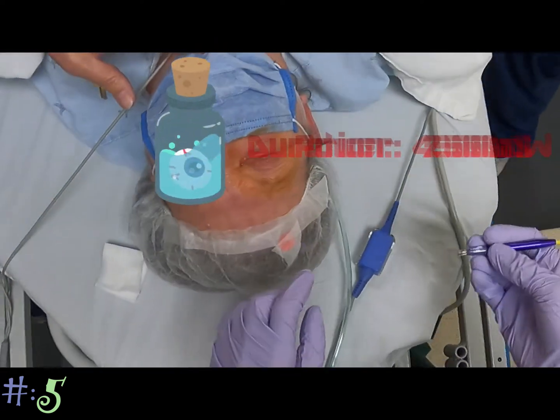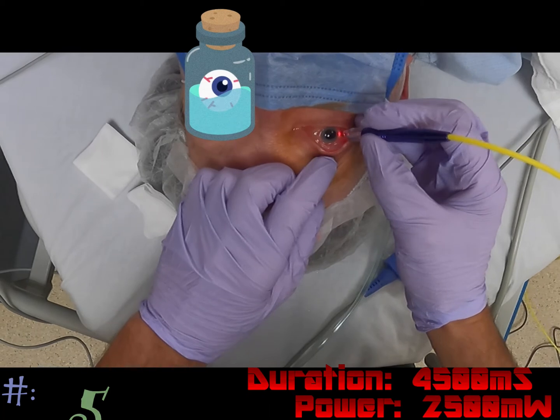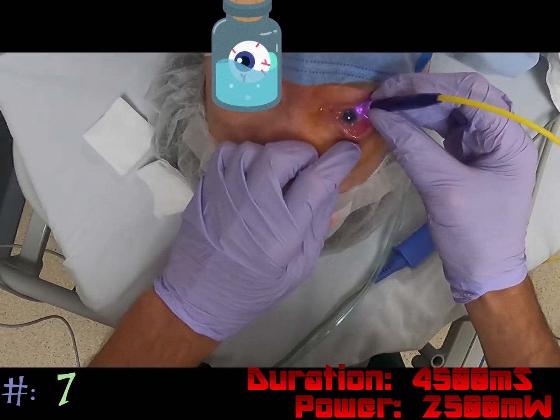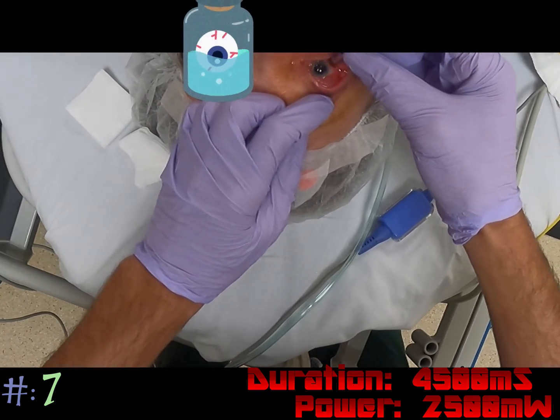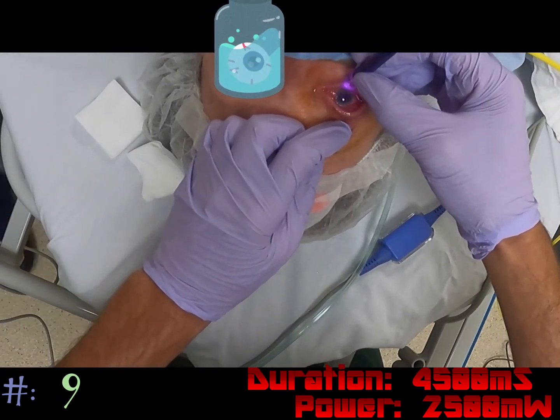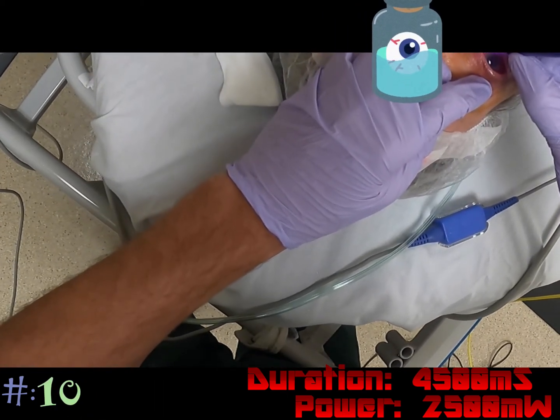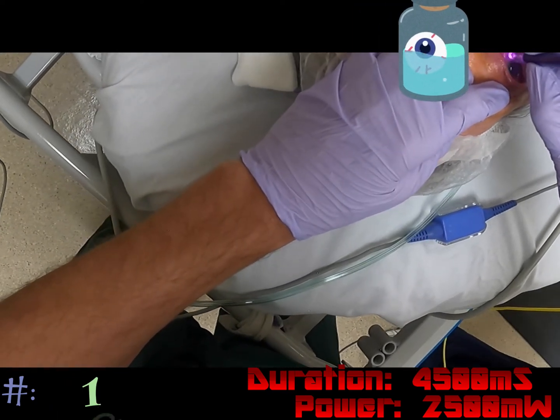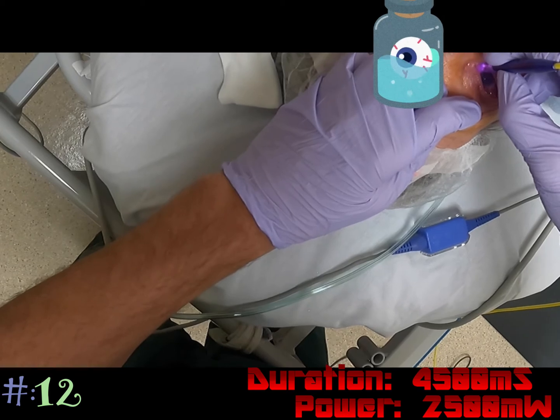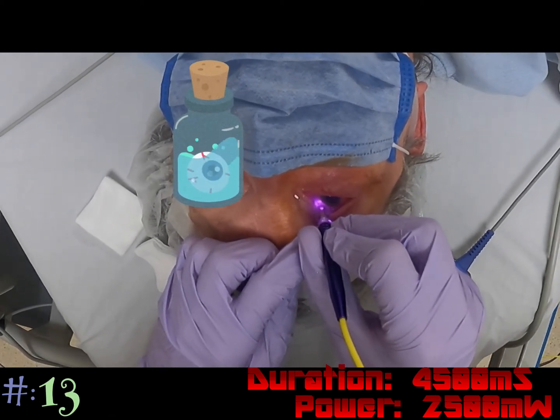We're going to do a full treatment here. The first treatment is about a millimeter to a millimeter and a half away from the limbus, and we're just going to slowly walk across the limbus. You could use a lid speculum, but I find they're difficult to use compared to just spreading the lids with your fingers — the speculum tends to get in the way and catch on the tip of the CPC probe. We're going to avoid three and nine o'clock because of the vascular supply to the eye, staying in between all the other clock hours. We're still doing this first row, just one millimeter away from the limbus.